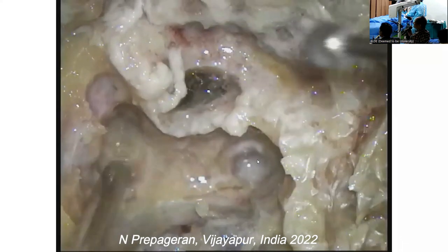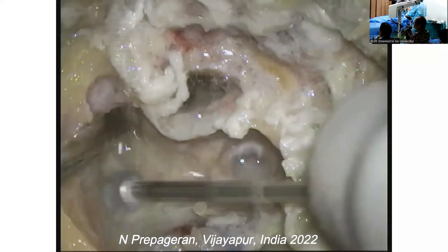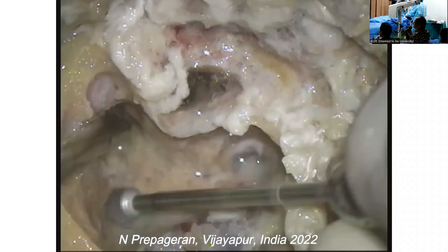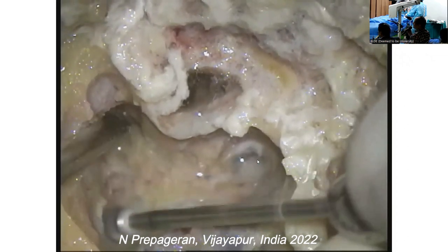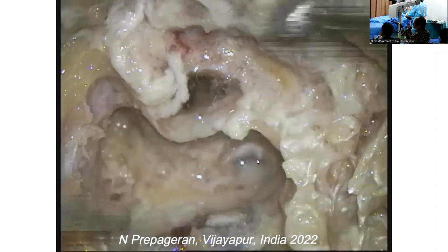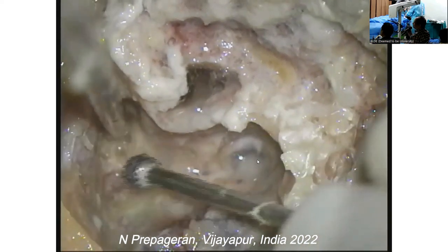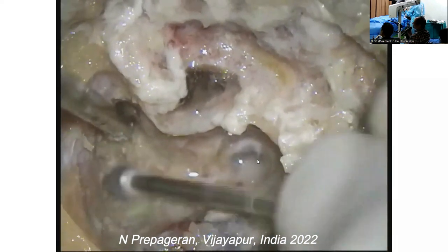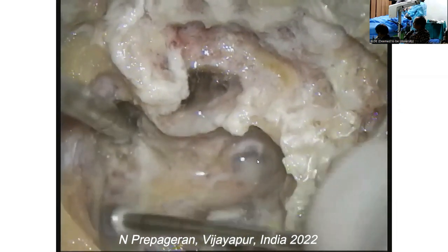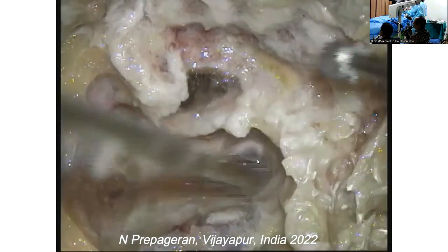This will prove dangerous. While the zygoma provides you the space when it is narrow here, at the same time, the dura also will come down. We have to keep this in mind when we are using the zygoma here for space. Now, this slant has to be kept in mind. So now, that's the superior petrosal sinus. Did you guys see that?